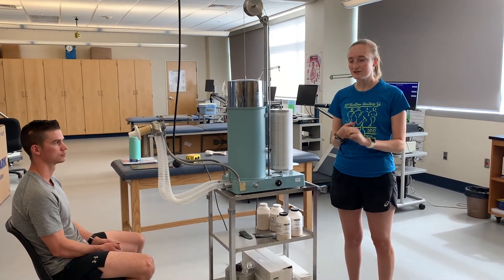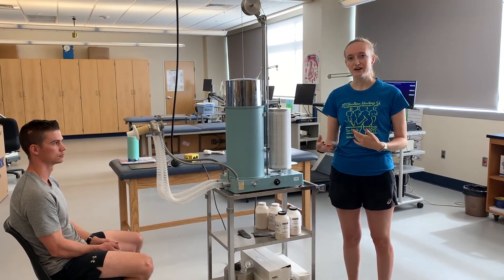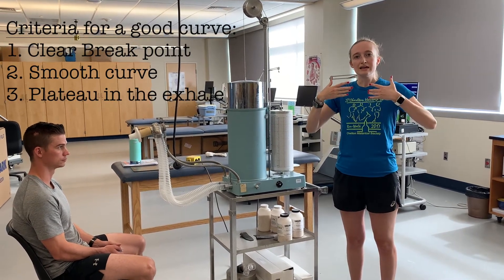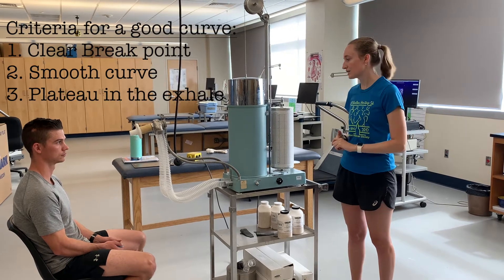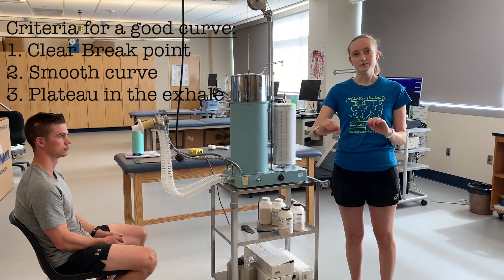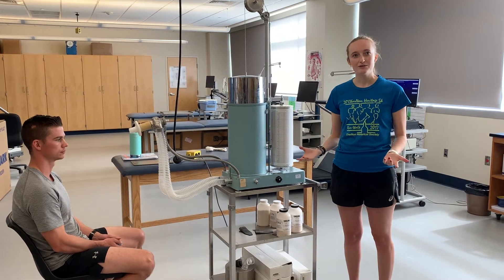Those are the three components we're going to be measuring using our bell spirometer. As you remember from lecture, we're going to do this three different times and we want three good curves. You may need to do it four or five times — whatever it takes. We want a nice break point where the person goes from their full inhale to starting that full exhale, a nice smooth curve during exhalation with no blips or minor inhales, and a good plateau at the bottom showing the person exhaled fully.